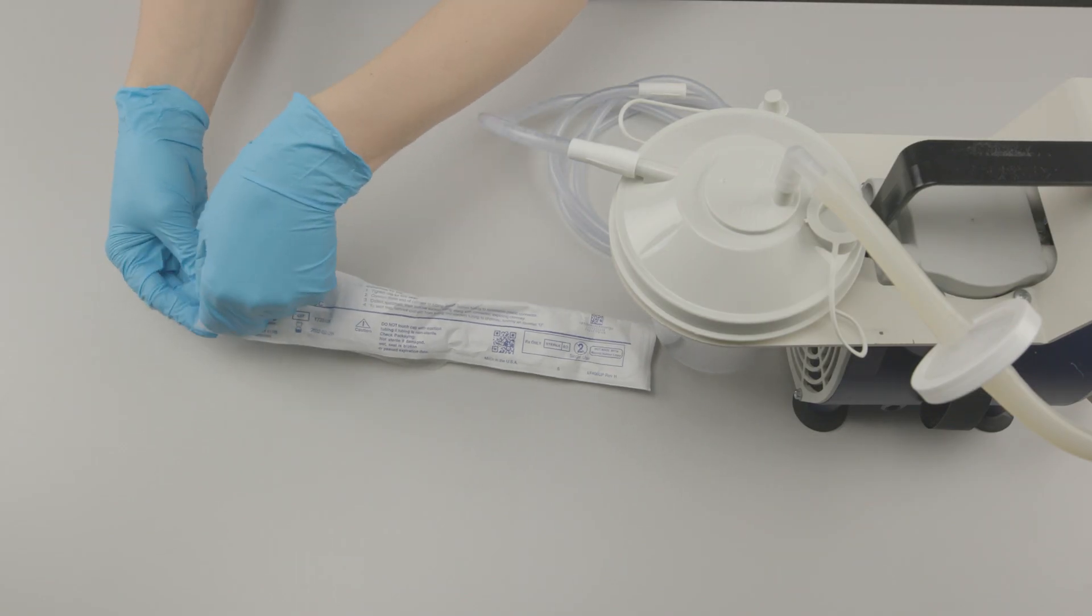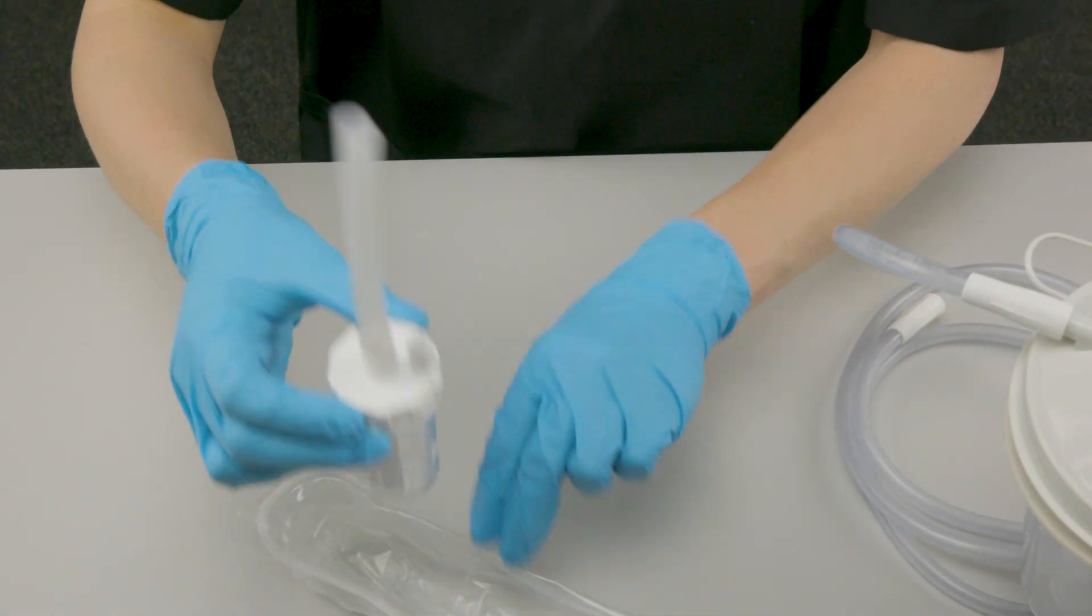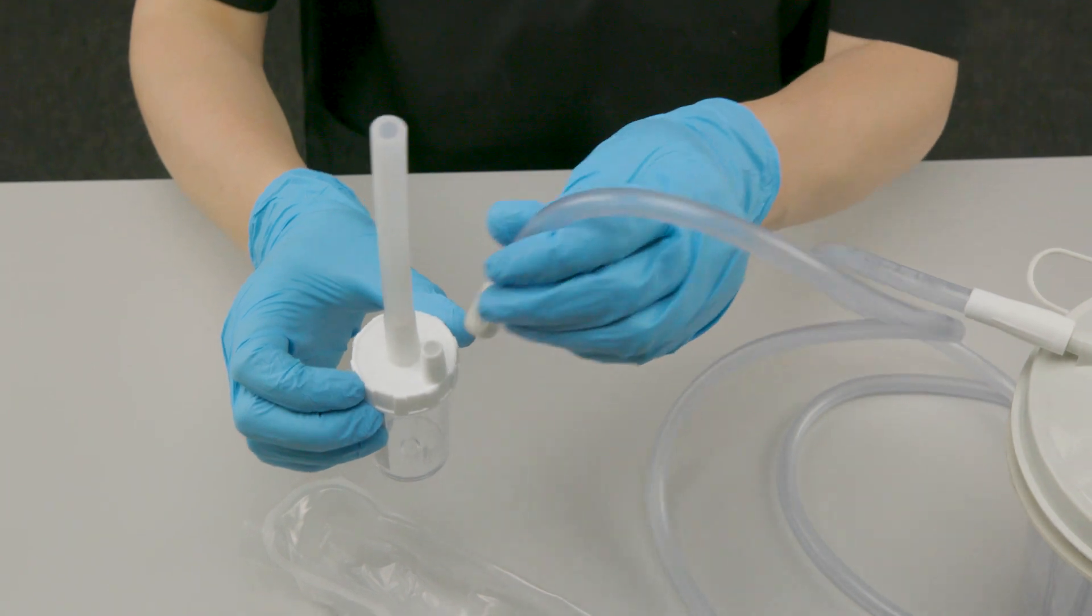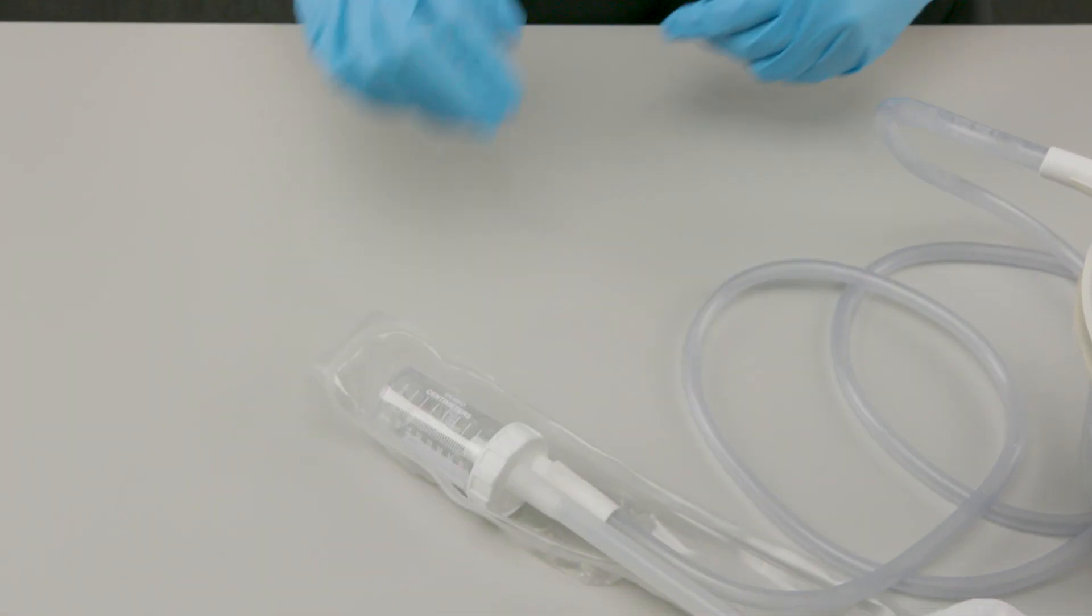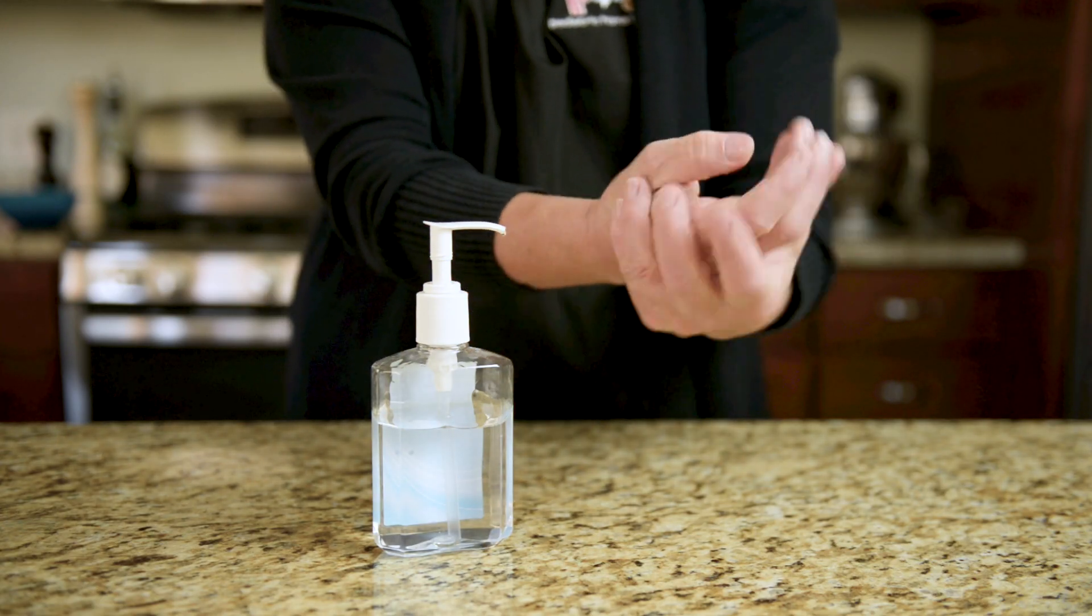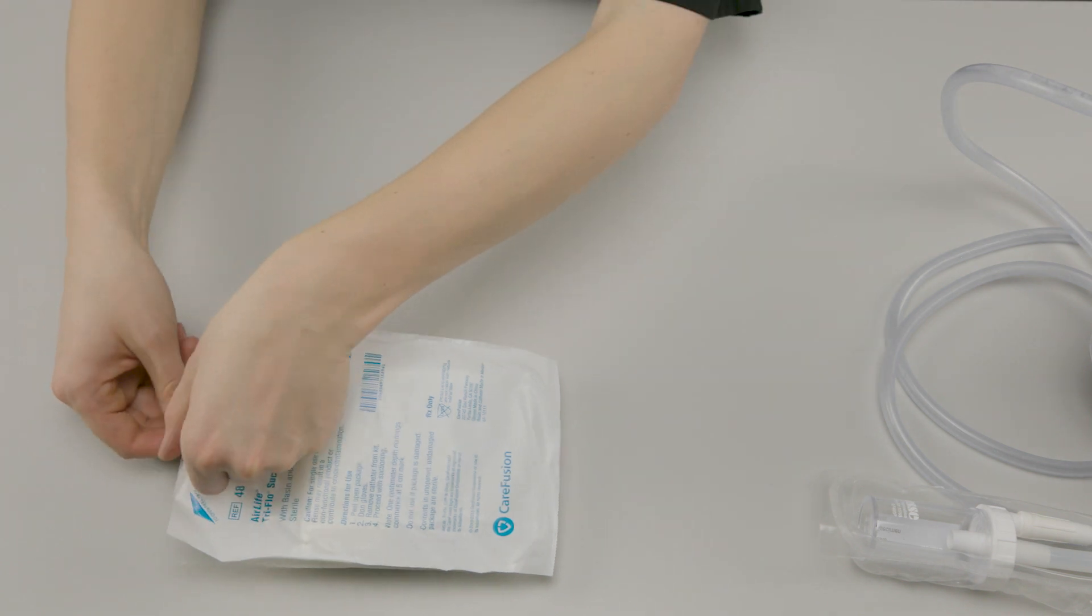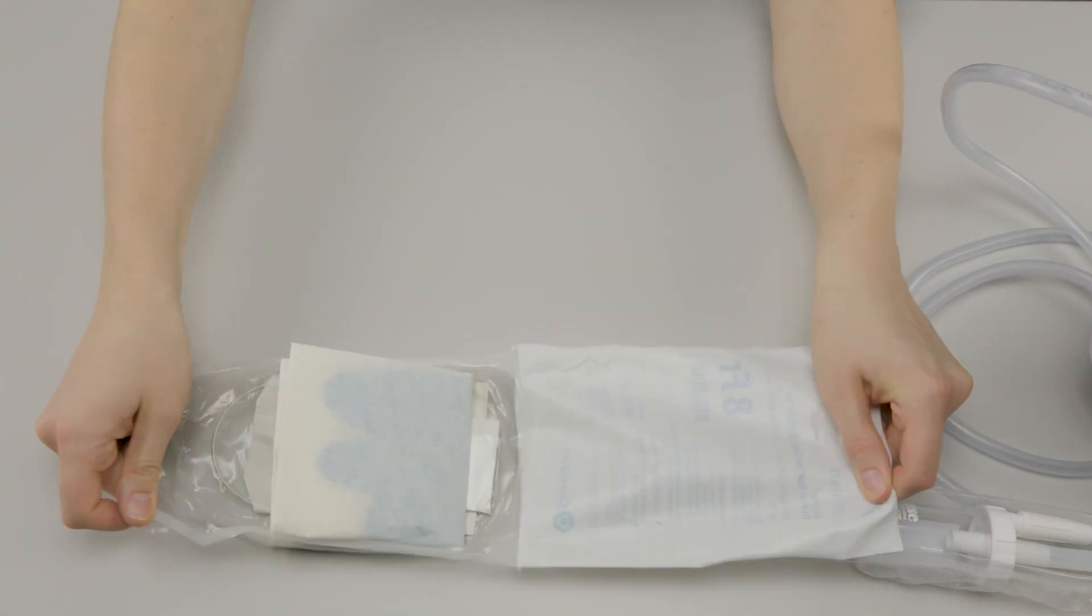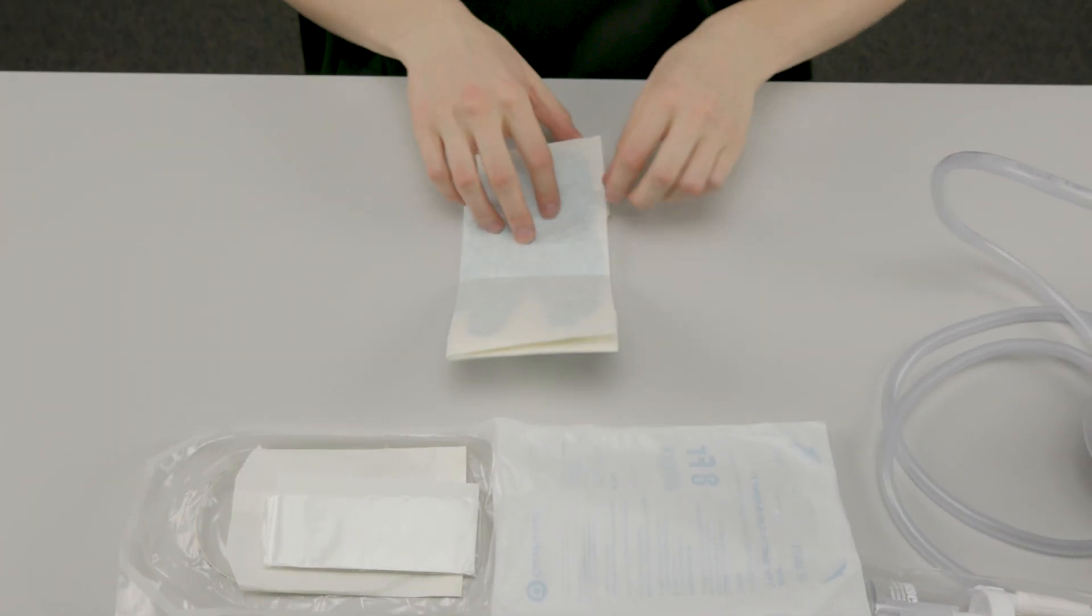Attach the specimen trap to the suction tubing. Remove the non-sterile gloves and clean your hands. Prepare the suction catheter kit using sterile technique. For a refresher on sterile suction technique, click here to watch the video.